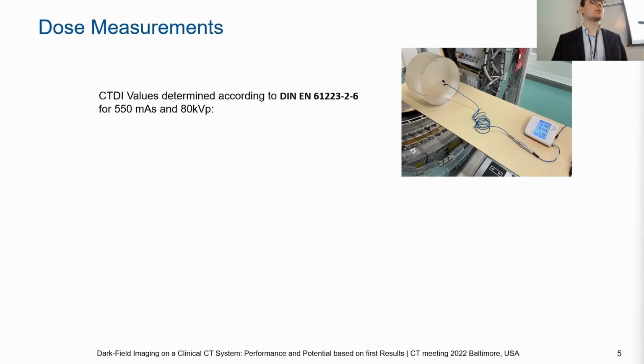But some systems can go lower. It's possible to go lower, right? You could go to 70 kVp. So do you think that would be better? We thought about that, but again, our issue here would be that the flux is probably too low. So while the visibility would be quite a bit higher, I don't think it's feasible.